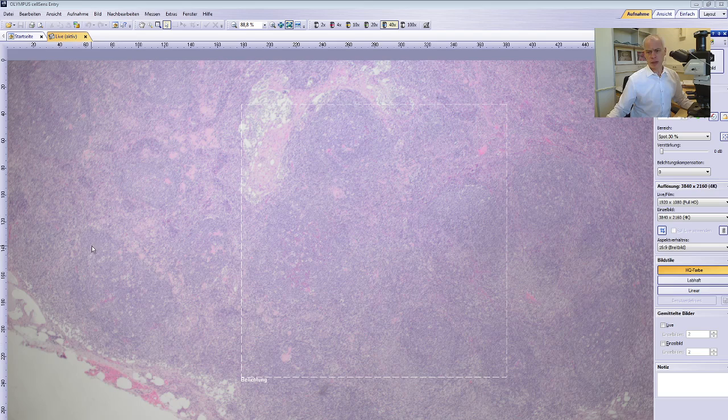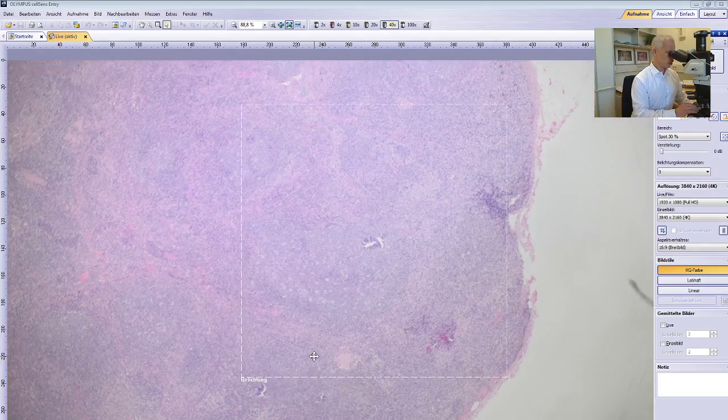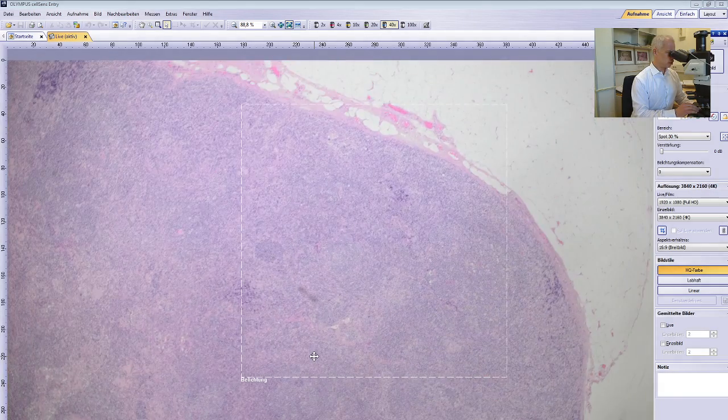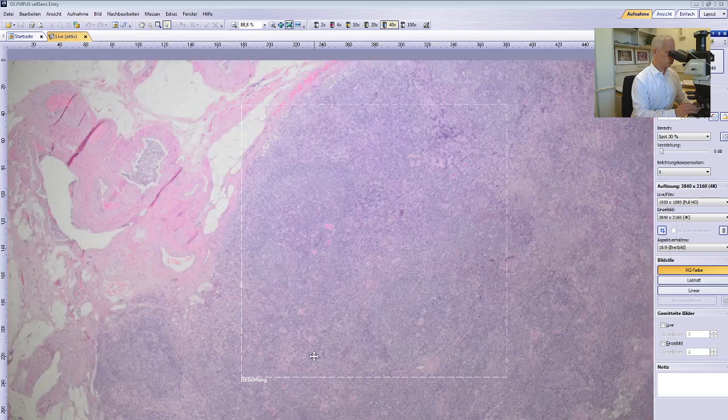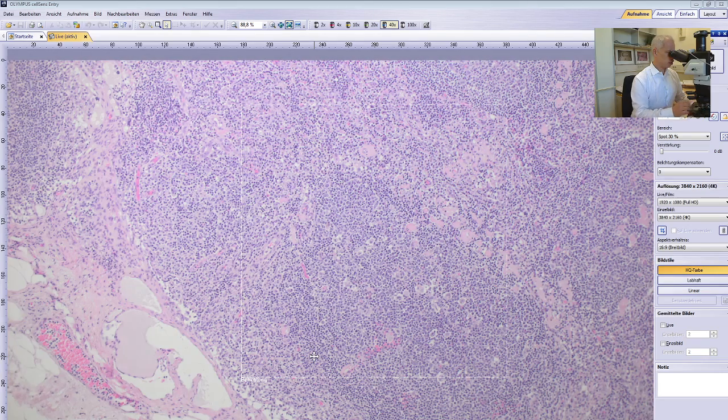I will look into that in detail. We see paler areas that we have to check. Maybe it's a T-cell nodule, or this is monocytoid B cells or plasmacytoid monocytes. And we're just moving over that, having in mind that we are looking for a diffuse large B-cell lymphoma, seeing that nodularity, this picture that's colorful, that's diverse, it's very unlikely that you find this lymphoma in here.